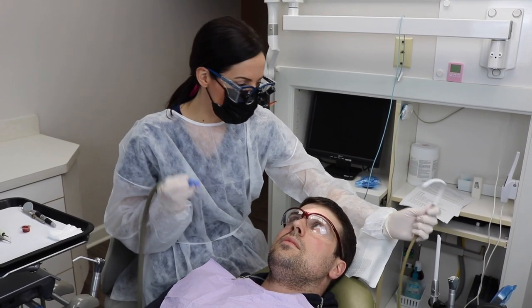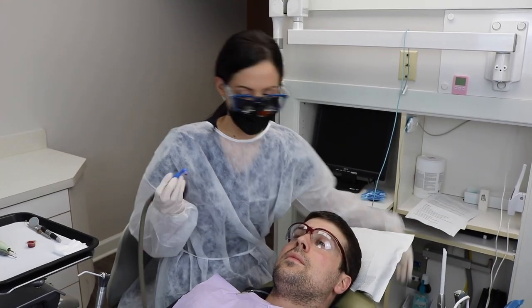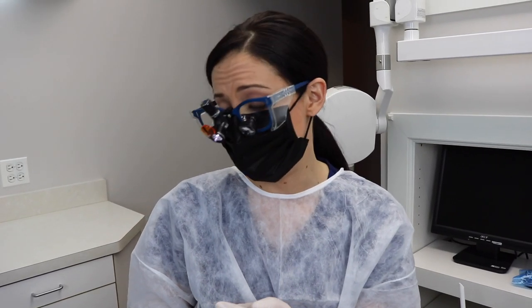Hello everyone! Another highly requested video from dental hygiene students specifically is polishing tips. Here's the thing — I am NOT an instructor by any means of dental hygiene. I'm not showing you technique; I'm just showing you some tips that hopefully help when you are stressing out over way too much polish happening.